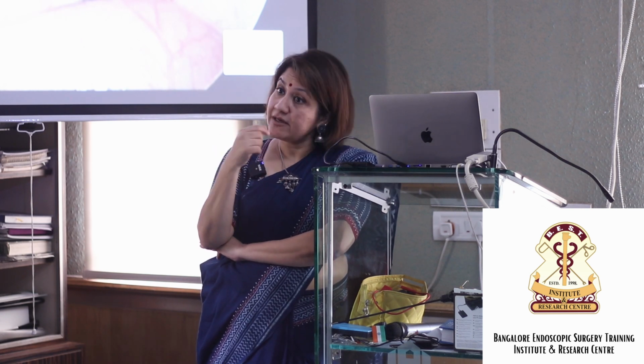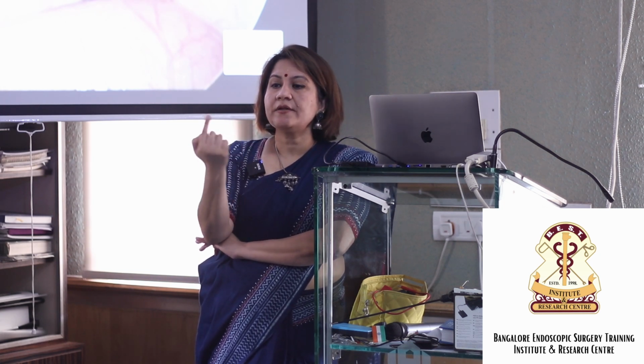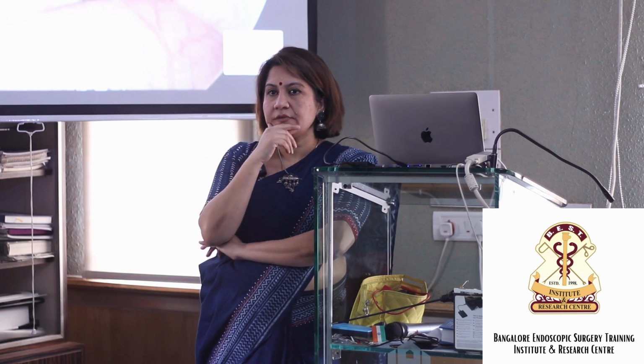But whom do I buy from? The cautery machine I buy from Allen Cautery. He is right now good and the cheapest for the bipolar. So he has a loop also, but his loop does not have 2 limbs. There's only 1 loop. It conducts electricity from the proximal to the distal end. That's what I use. Laparoscopic bipolar cutting is good with Allen.